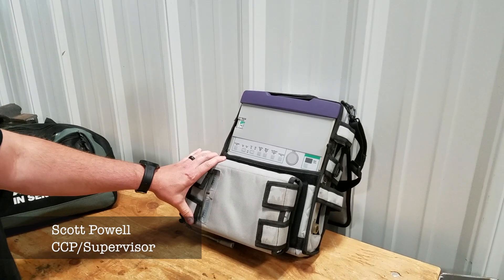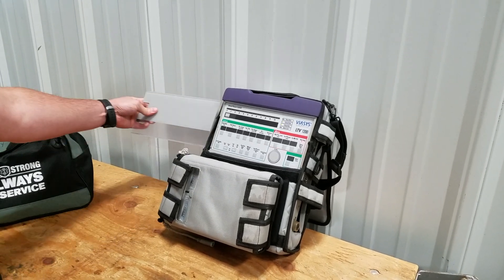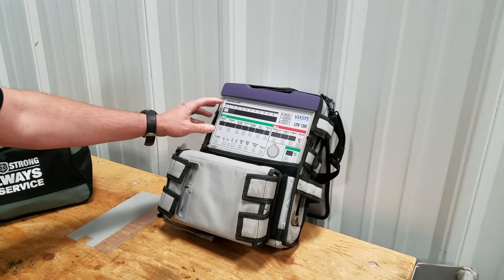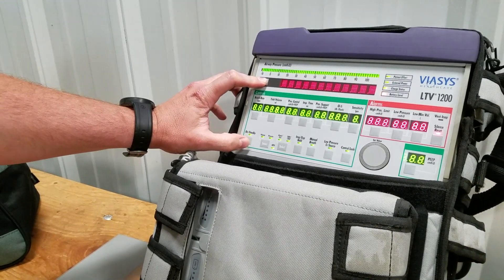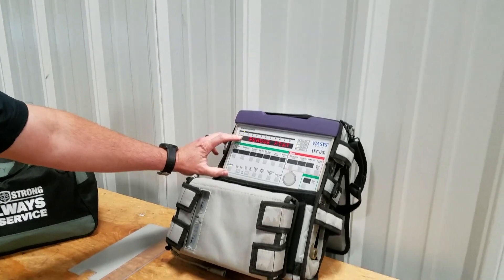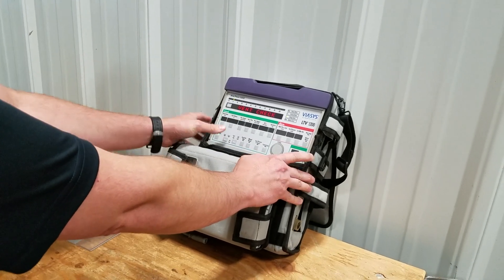Today we're going to go over how to do a vent check on the LTV 1200. First thing we're going to do is slide the protective cover off — that'll expose all of our buttons. From here we're going to press and hold the select button and then press the on/standby button. It will power up, say 'remove patient,' we hit the silence button, and it will say 'vent check.'